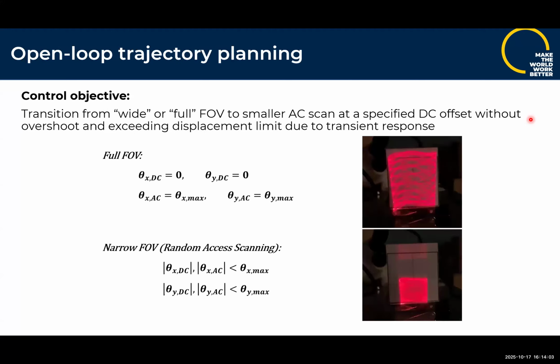And so we're looking at some ways to deal with this. One of the things we looked at was just an open loop. Can we design trajectories that are robust to transitions without breaking this pattern? This is what Hangji worked on. Essentially, you start out running your device at its initial centered on 0 and with its maximum range of motion.